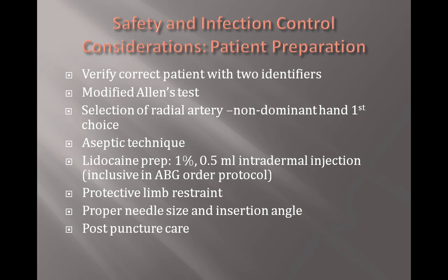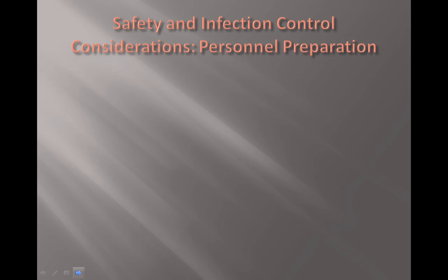So if you're urgently drawing an ABG and your patient is anticoagulated, you might want to tell a buddy so they can swing by and pick up your specimen while you maintain an adequate amount of pressure. Be aware that if your patient is anticoagulated or has any underlying blood dyscrasias, this will increase their risk of bleeding and its associated complications. In these cases, you'll just want to take the time to explain this to your patient and maintain pressure longer to reduce their risks.